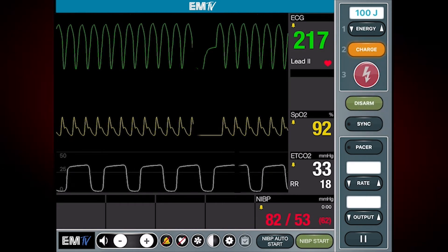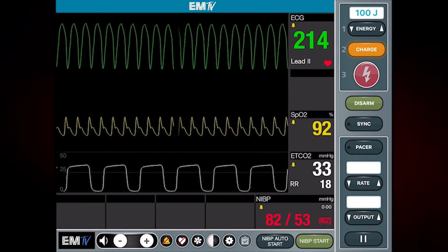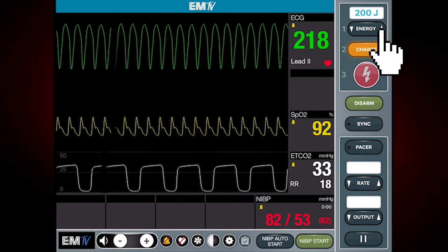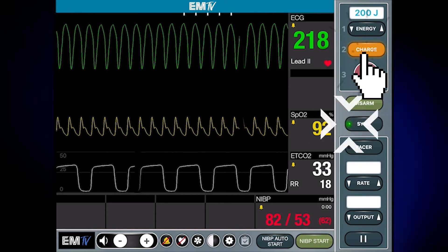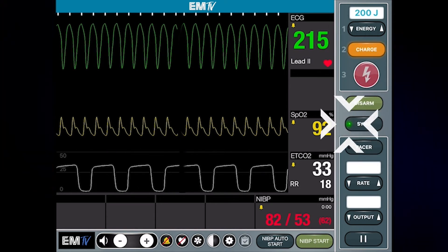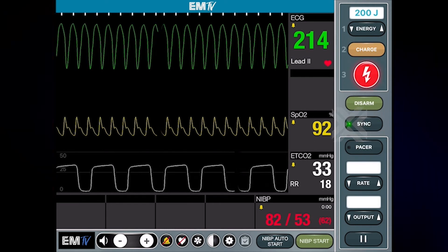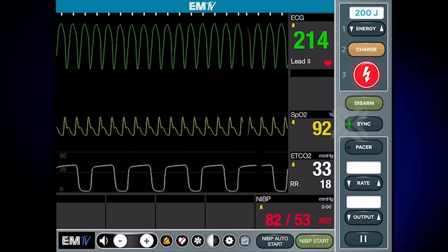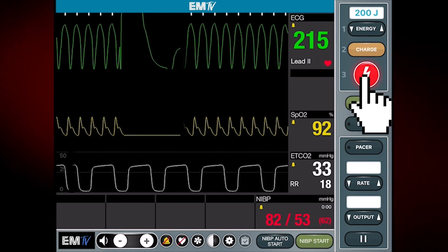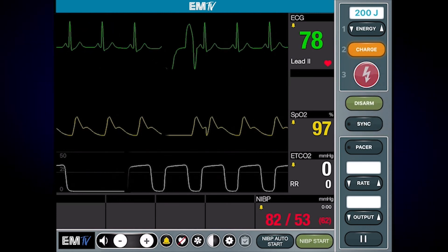As the initial shock was ineffective, I will prepare to administer another using a higher energy setting. At this point, it's a good idea to assess your patient's condition. Make sure all team members are clear before you deliver the shock. Reassess the patient and all vital signs.